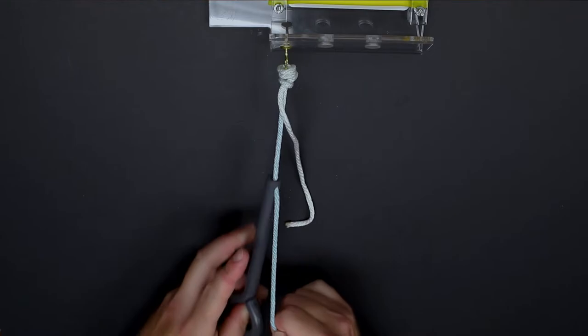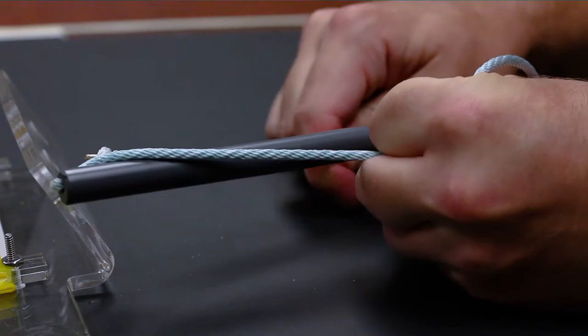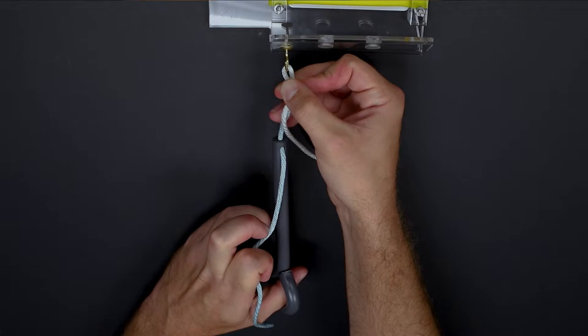We can then secure this against the tissue using our knot pusher to further push it against the tissue and then we can further tighten it, past pointed, for additional tension.